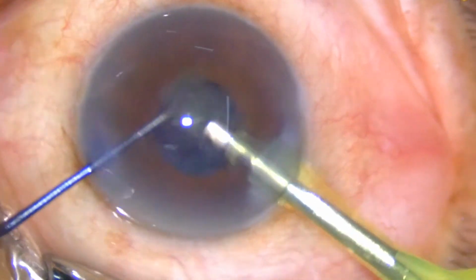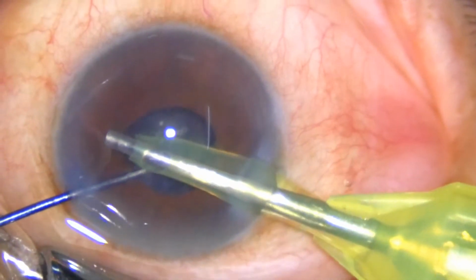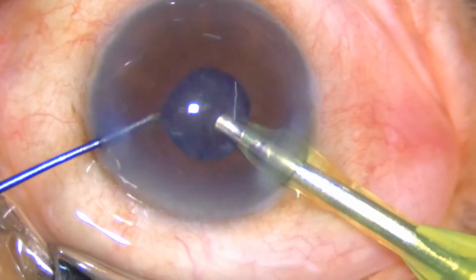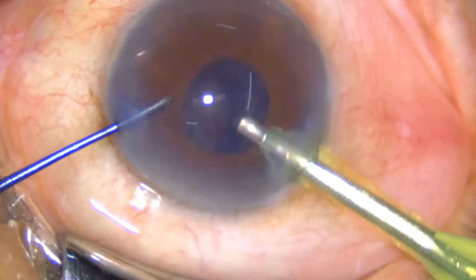It is good if you can take your epinuclear plate with the help of the phaco probe, because that will make things much easier.